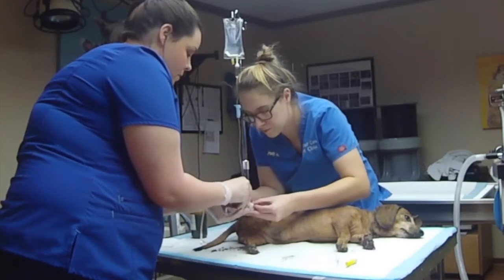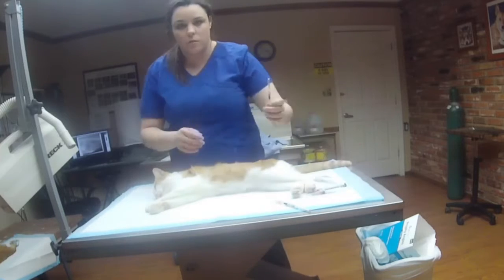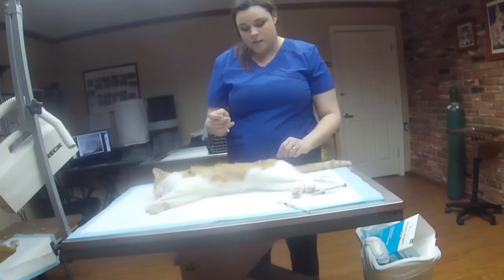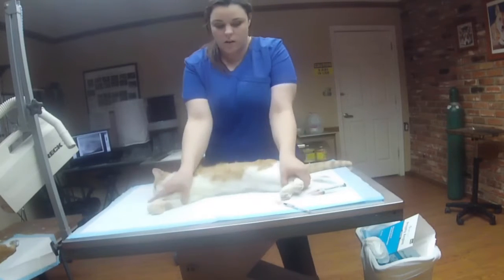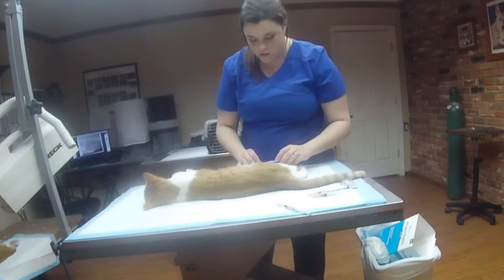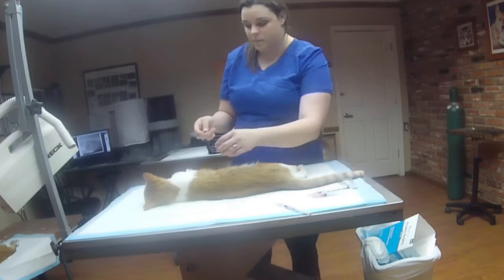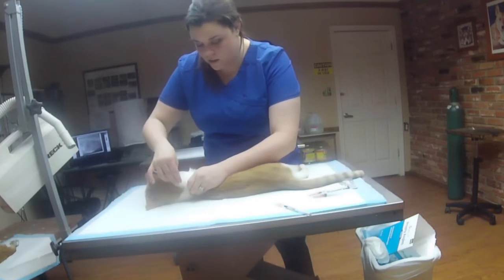Okay. To do a subcutaneous injection, we're going to give this cat his meloxicam. Let me turn it around better. For his pain medicine from his neuter. Okay, so you're going to want to insert the needle and just go directly under the skin.